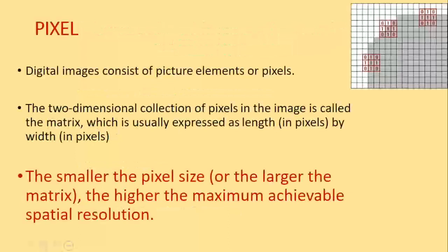Now, let's look at pixels. I told you there are like 47 odd machines with 20 odd manufacturers. Generally, all of them have the same configurations, one doing better than the other with small differences. But if there's a shortcoming of the image, then these are four things you look at. One of them is pixel.